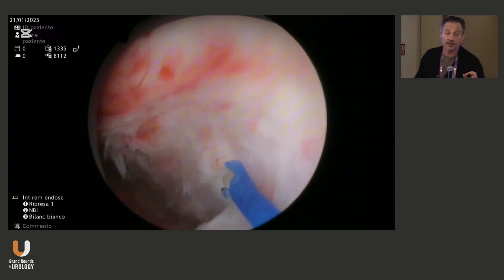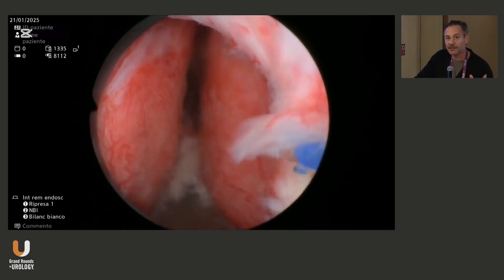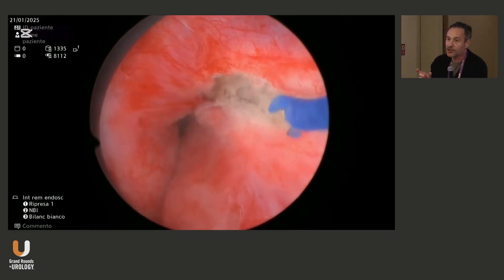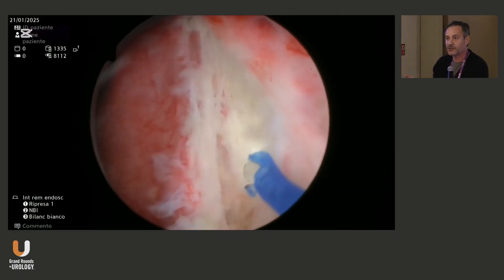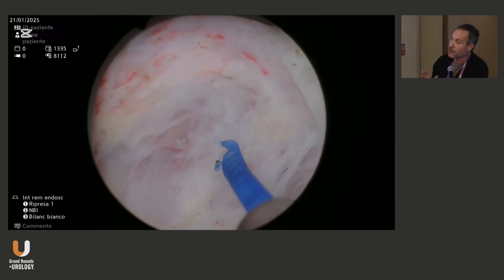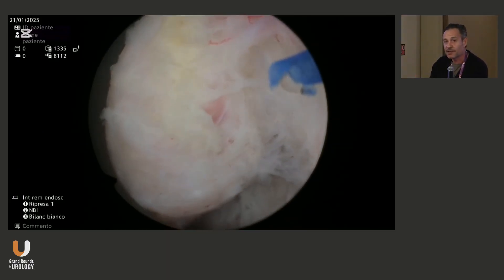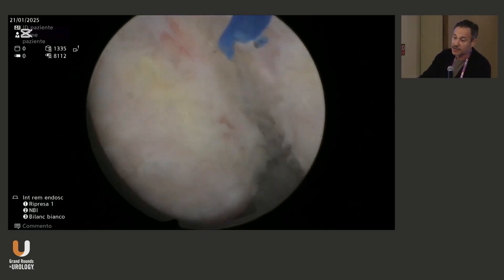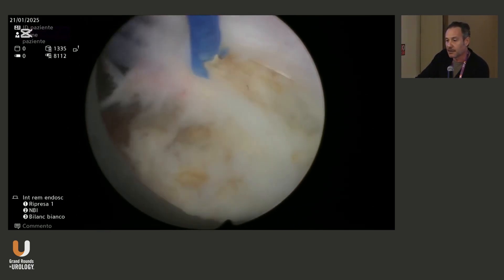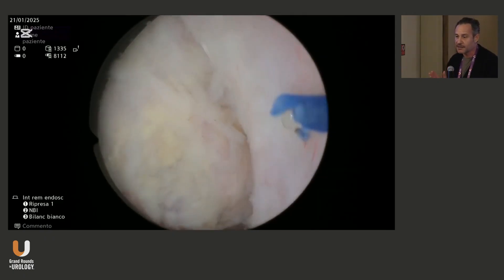Now we move to the apex — this is a very important part. I strongly believe that the apex shape is one of the reasons why we may have different outcomes in stress urinary continence after the procedure. It depends on the volume of the gland; the larger the apex, the more likely we will experience stress urinary incontinence. We have published studies on prostate shape after radical prostatectomy showing that once the apex overcomes the sphincter, we may have more incontinence. But if the prostate shape is like an apple shape without overlapping the sphincter, this helps recovery of continence.